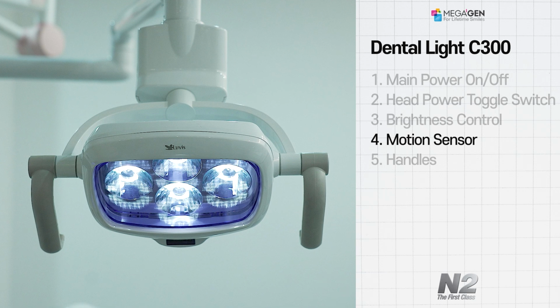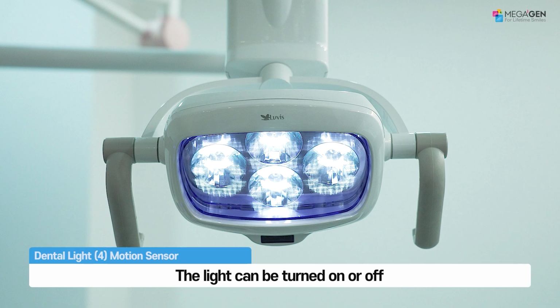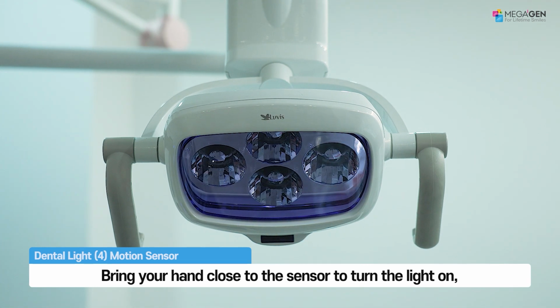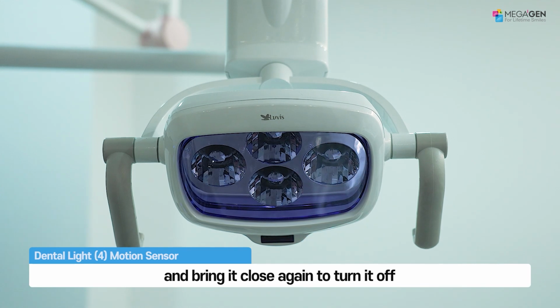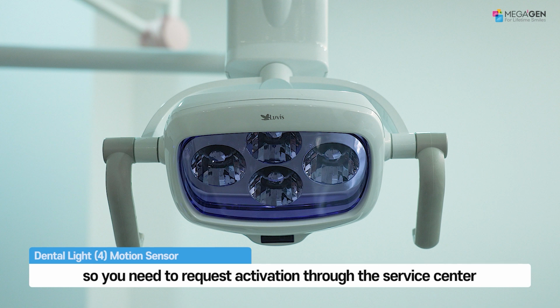Using the light's touchless motion sensor for power on/off. The light can be turned on or off using the motion sensor located on the front of the light. Bring your hand close to the sensor to turn the light on, and bring it close again to turn it off. The motion sensor is generally delivered disabled, so you need to request activation through the service center.